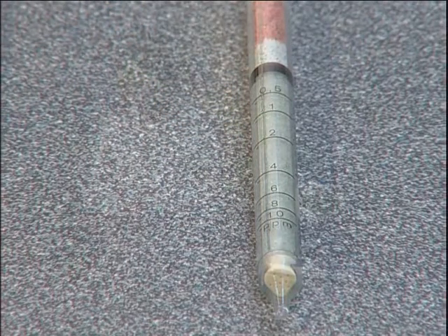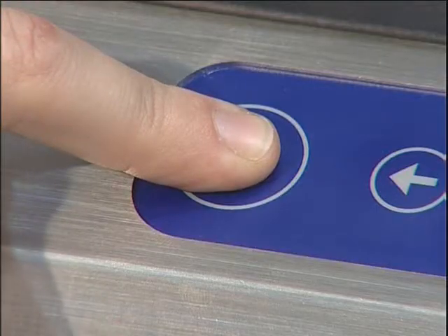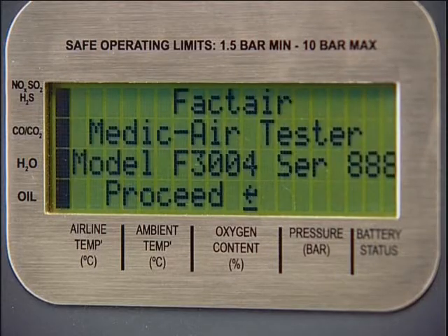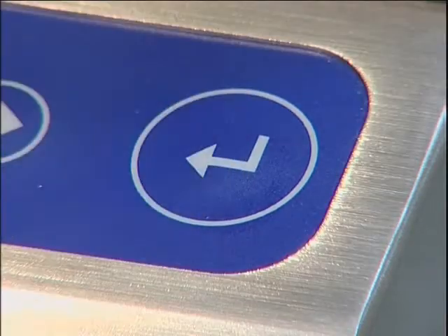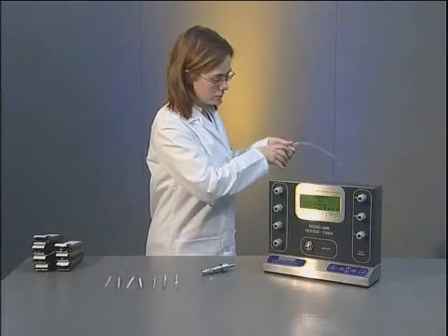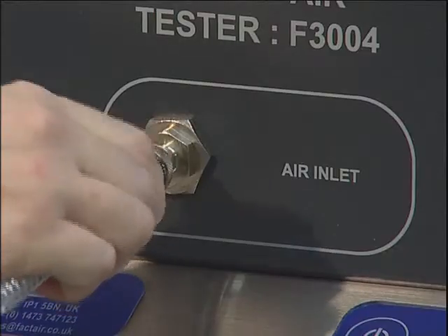To carry out a test, first switch on the machine by pressing and holding the on-off button on the keypad for approximately two and a half seconds. The display will show both the model and serial numbers. If the battery condition is OK, press ENTER and press ENTER again to acknowledge the date of the last calibration. Using the non-toxic hose provided, connect the F3004 to the system to be tested.